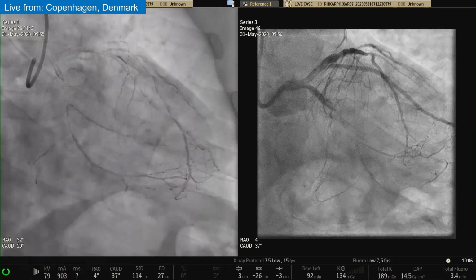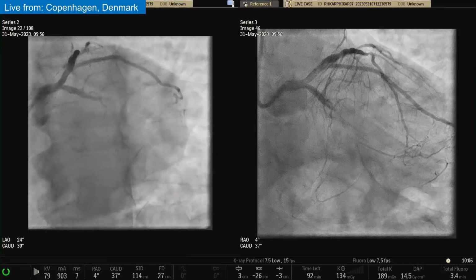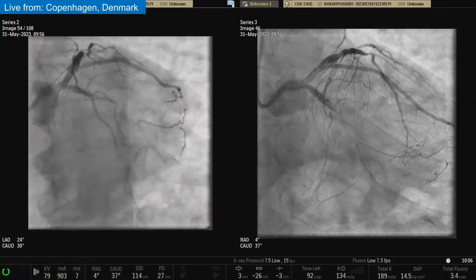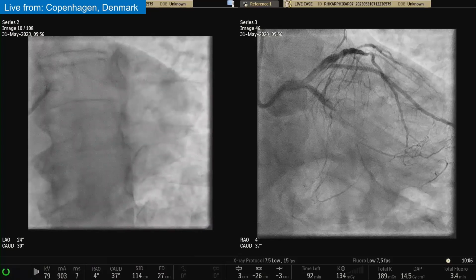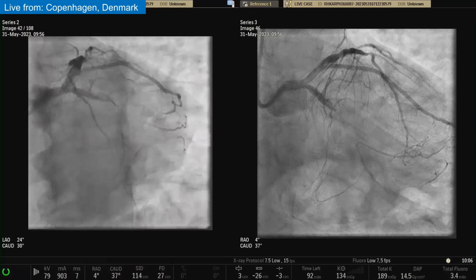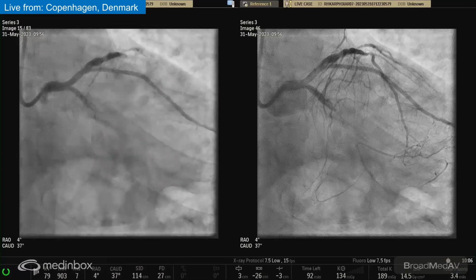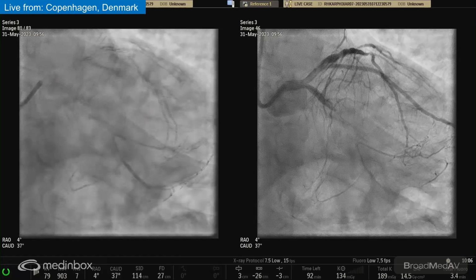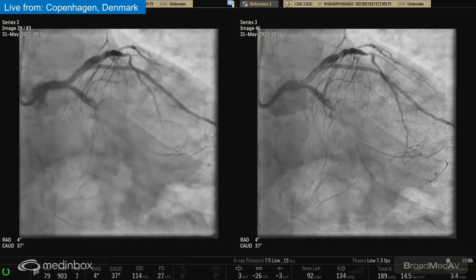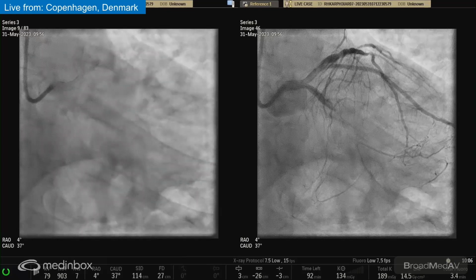We think there might be a microchannel. We're not that sure. We haven't tried it yet. You can see the setup shots. It seems that there might be a small channel. There's probably a tapered proximal cap. There's a short side branch taken off just above the proximal cap. And there's a bifurcation at the distal cap.